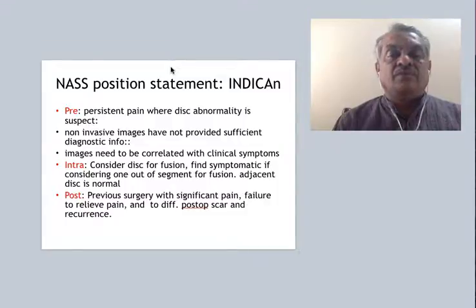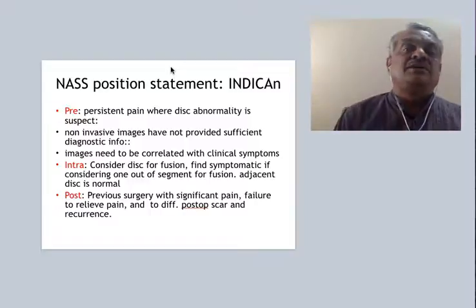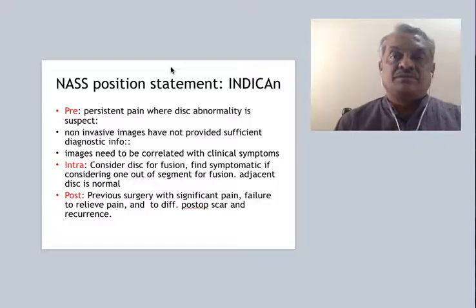And if we are considering one out of many segments for fusion, then we must do a discogram to identify which amongst the many is the cause of the symptoms, especially if the adjacent disc is normal. And to confirm that the adjacent disc is normal, we do a discogram in that disc also.